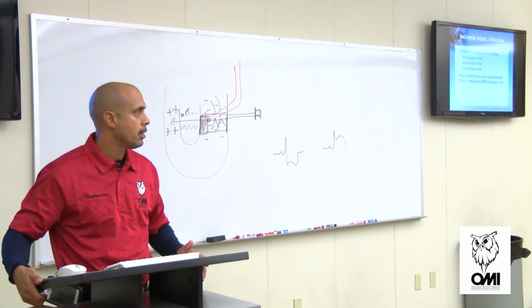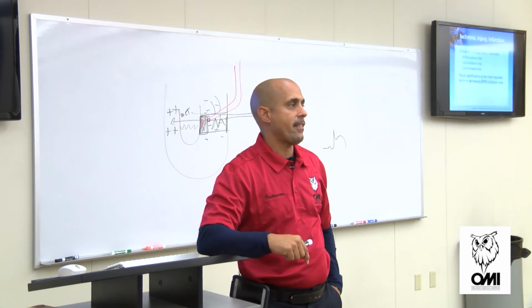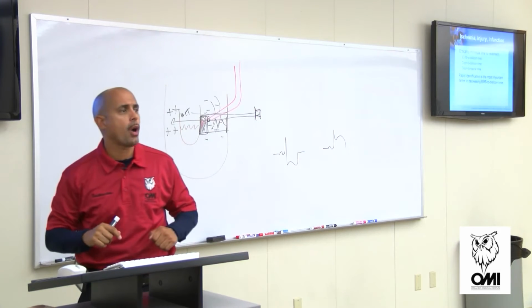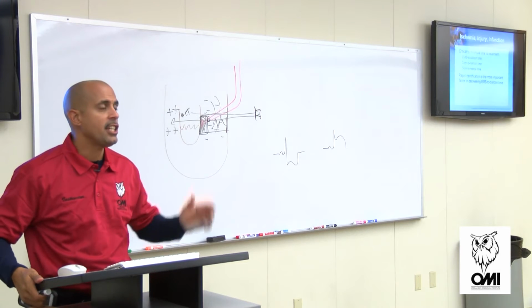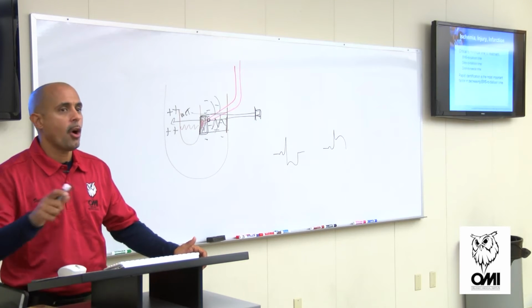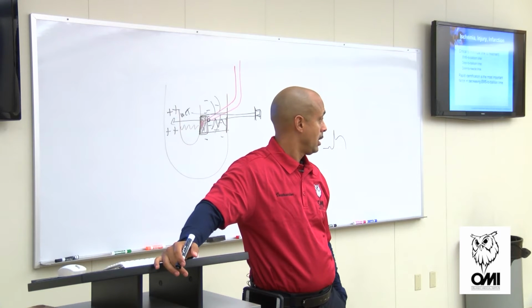Yes. So what you're saying is I could have a patient who's presenting to me like he's having a heart attack, symptomatic, cool, pale, diaphoretic, crushing chest pain, the whole nine yards. But when I do a 12 lead, I see no ST changes. Does it mean he's not having an MI? It just means to me, it's not what yet? Transmural.